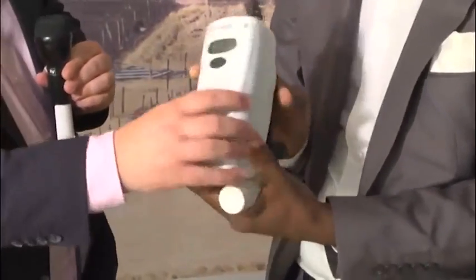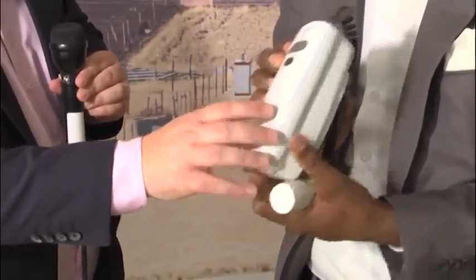And it doesn't have an LCD screen on it, but what can you pick up with this? You use the gel for the fetal heart rate. Right. Pregnant women can be checked. You identify any abnormalities or complications during pregnancy. You palpate, still continue the palpation of the midwife.